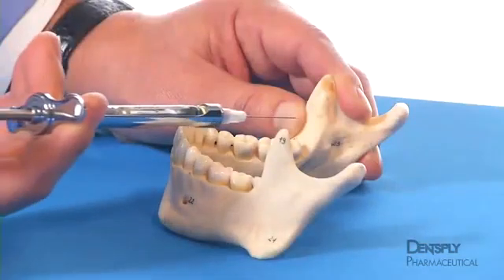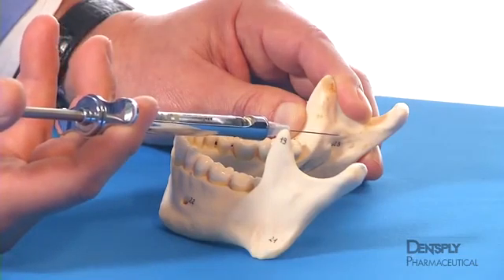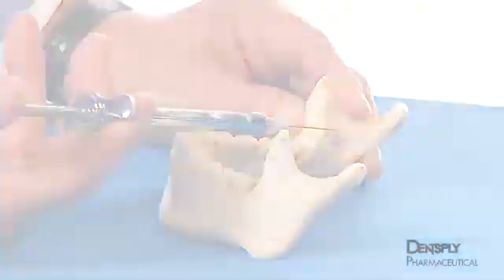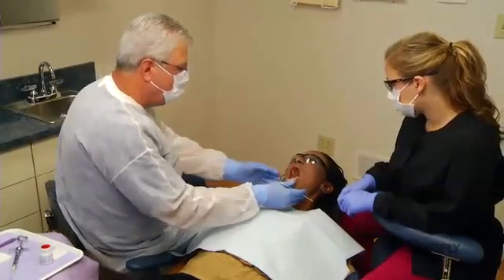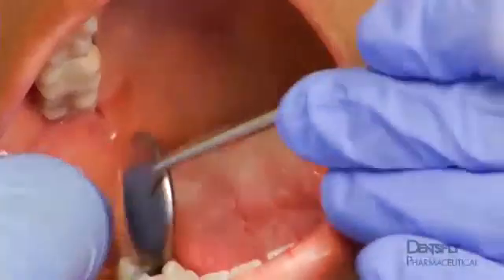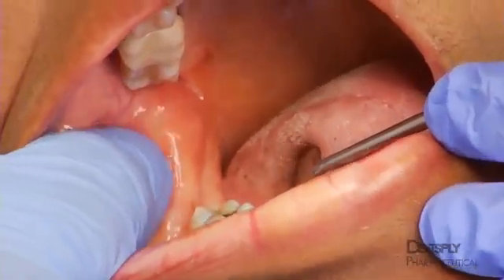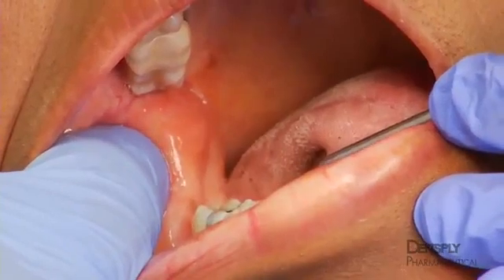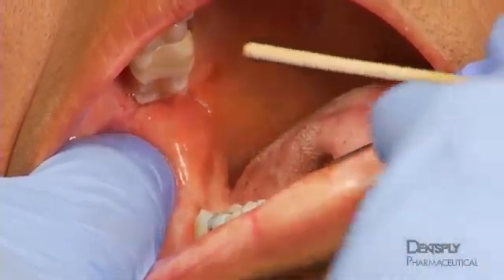Because of the lateral flare of the ramus, the syringe must be advanced from the contralateral premolar region for the needle to enter the sulcus. Clinically, the coronoid notch is determined by palpating the most lateral aspect of the anterior ramus. Here, the thumb, kept parallel to the mandibular occlusal plane, is moved into position within the coronoid notch. A line bisecting the thumbnail establishes the height of injection.